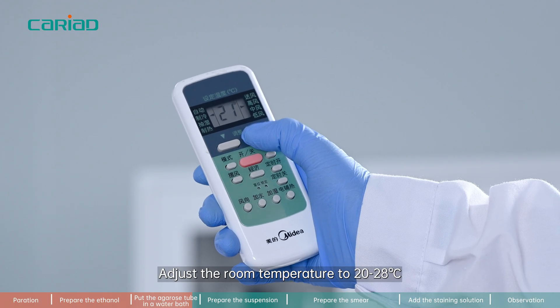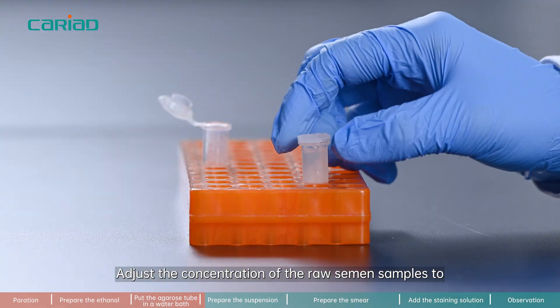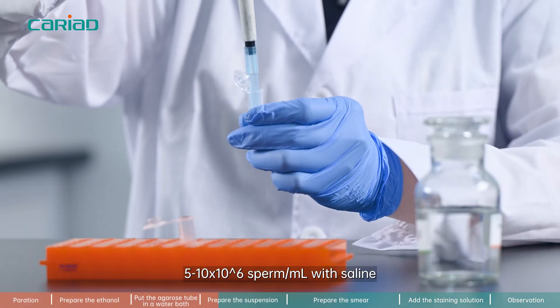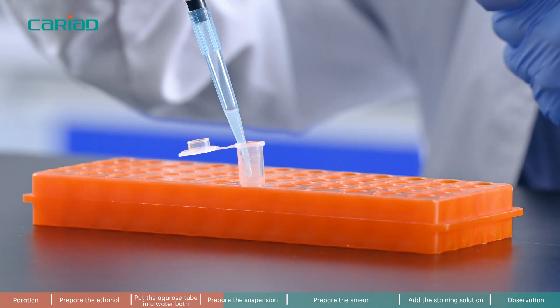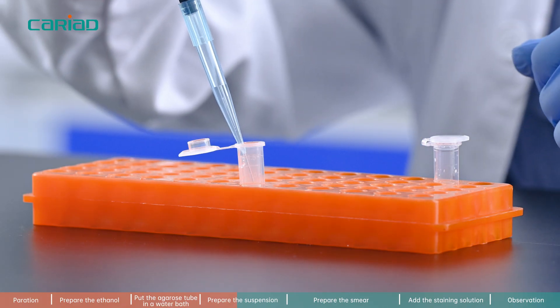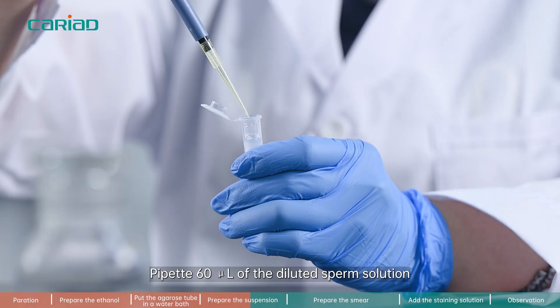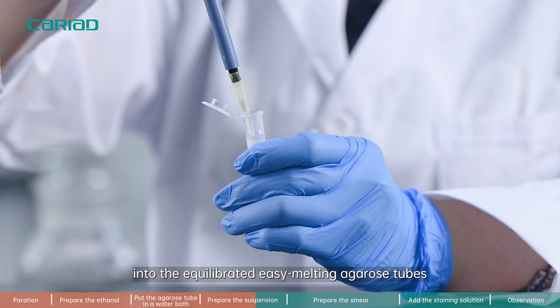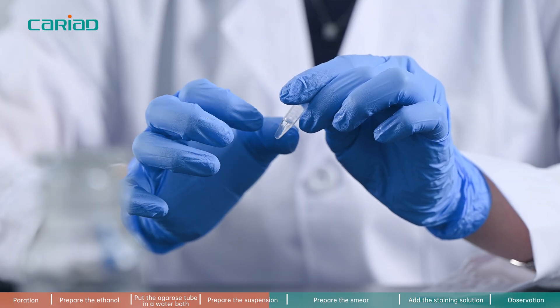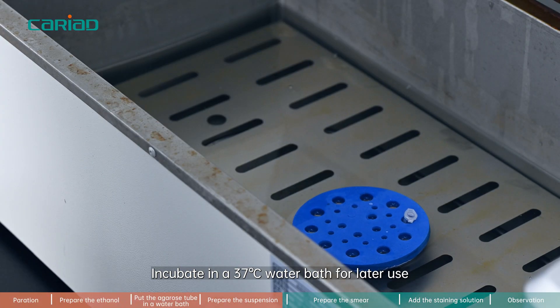Step 3. Adjust the room temperature to 20 to 28 degrees Celsius. Step 4. Adjust the concentration of the semen samples to 5 to 10 × 10⁶ sperm/ml with saline. Pipette 60 microliters of the diluted sperm solution into the equilibrated easy melting agarose tubes. Mix well and incubate in a 37 degrees Celsius water bath for later use.